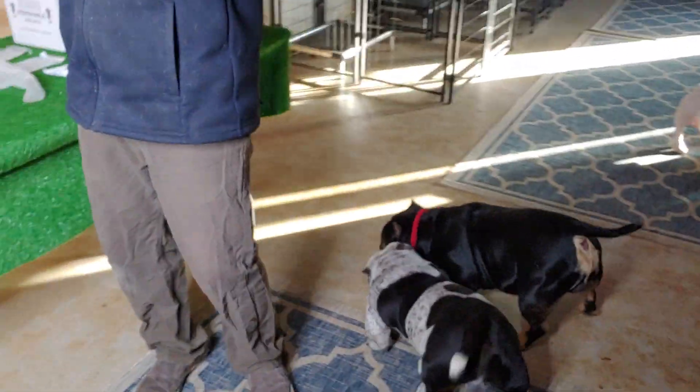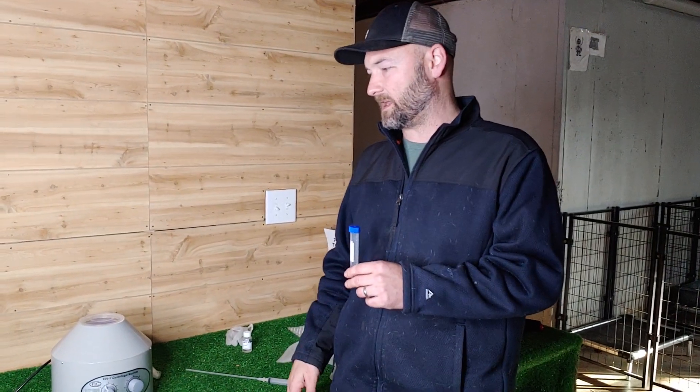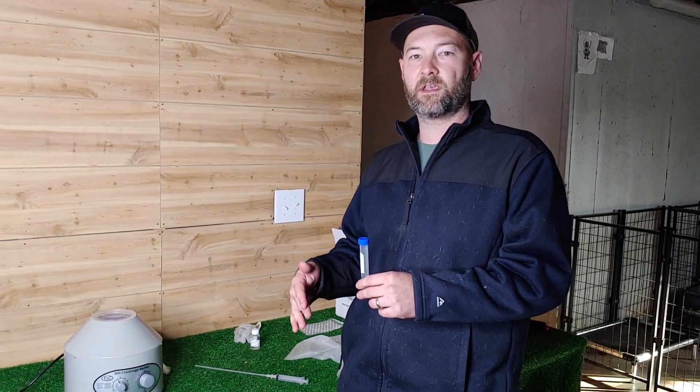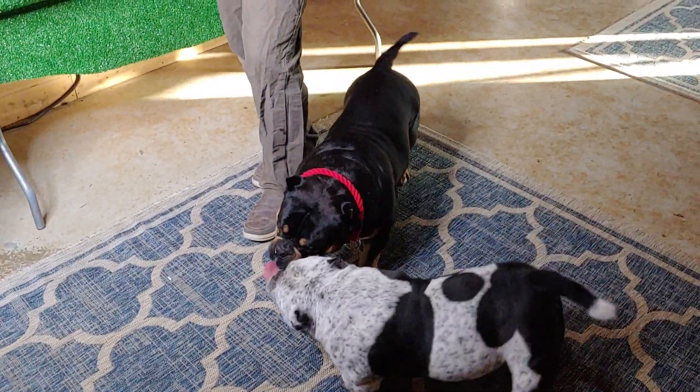We started doing this preparation process even for our in-house, in-person artificial inseminations. So if you use one of our studs and you come to do an in-person breeding, we'll invite you down to my basement, show you all the dogs, spin down the semen, add the semen extender, and before we put it in your female we'll do the same thing.